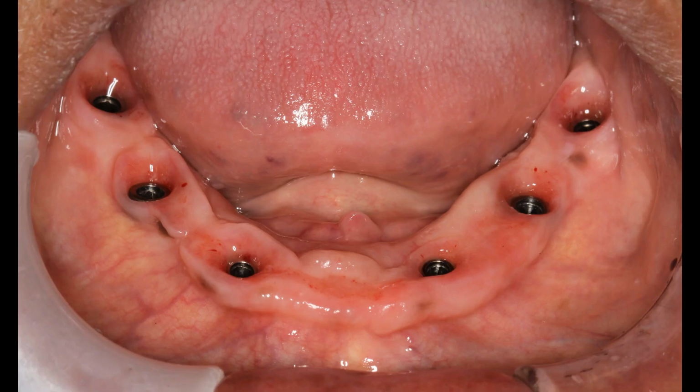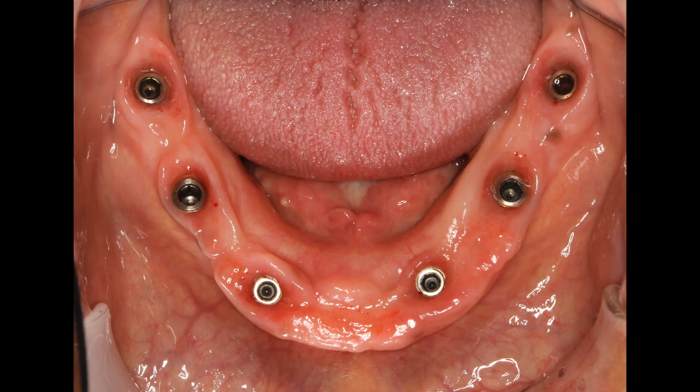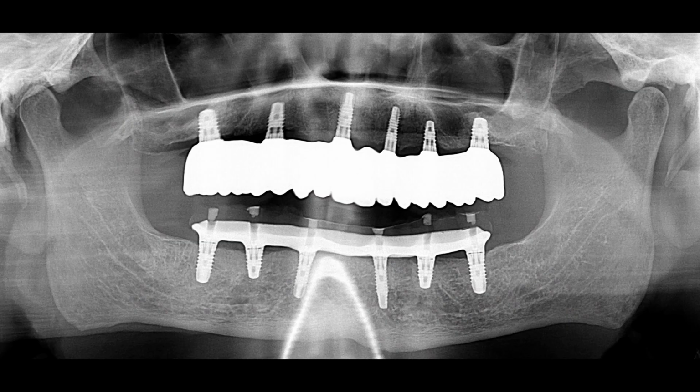This is the patient's post-operative full face smiling picture. The patient thought he had something stuck under his lower prosthesis, so it gave me the opportunity to remove it and take some more pictures. So what I wanted to show you here was the red that you saw from the temporaries is just about all gone, and with the titanium or the zirconium on the tissues, we tend not to have any allergic reaction, and the tissues return to pink and healthy. The mirror shot just demonstrating how healthy these tissues are. Here is the final x-ray of both upper and lower implants and final prosthesis.